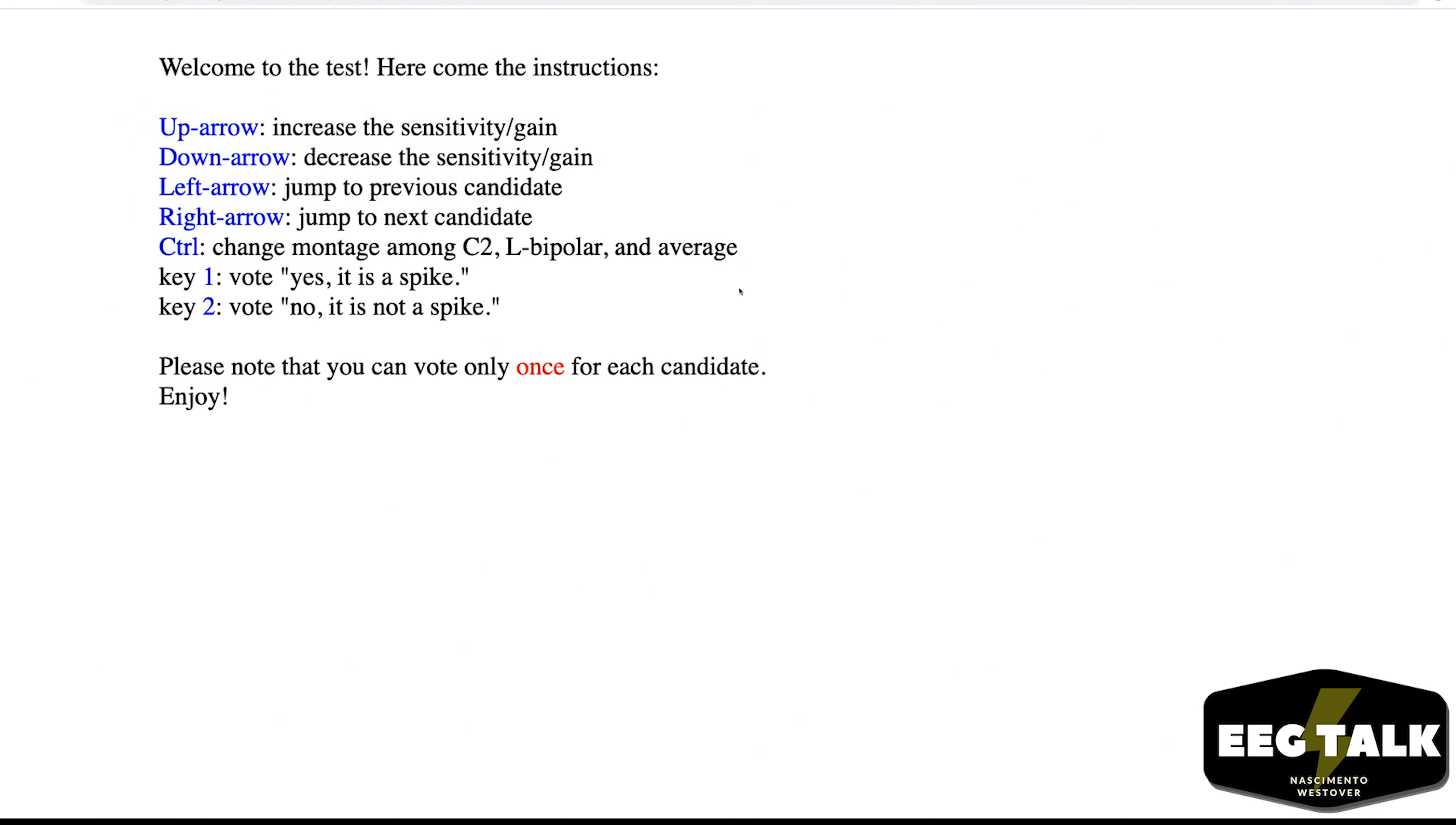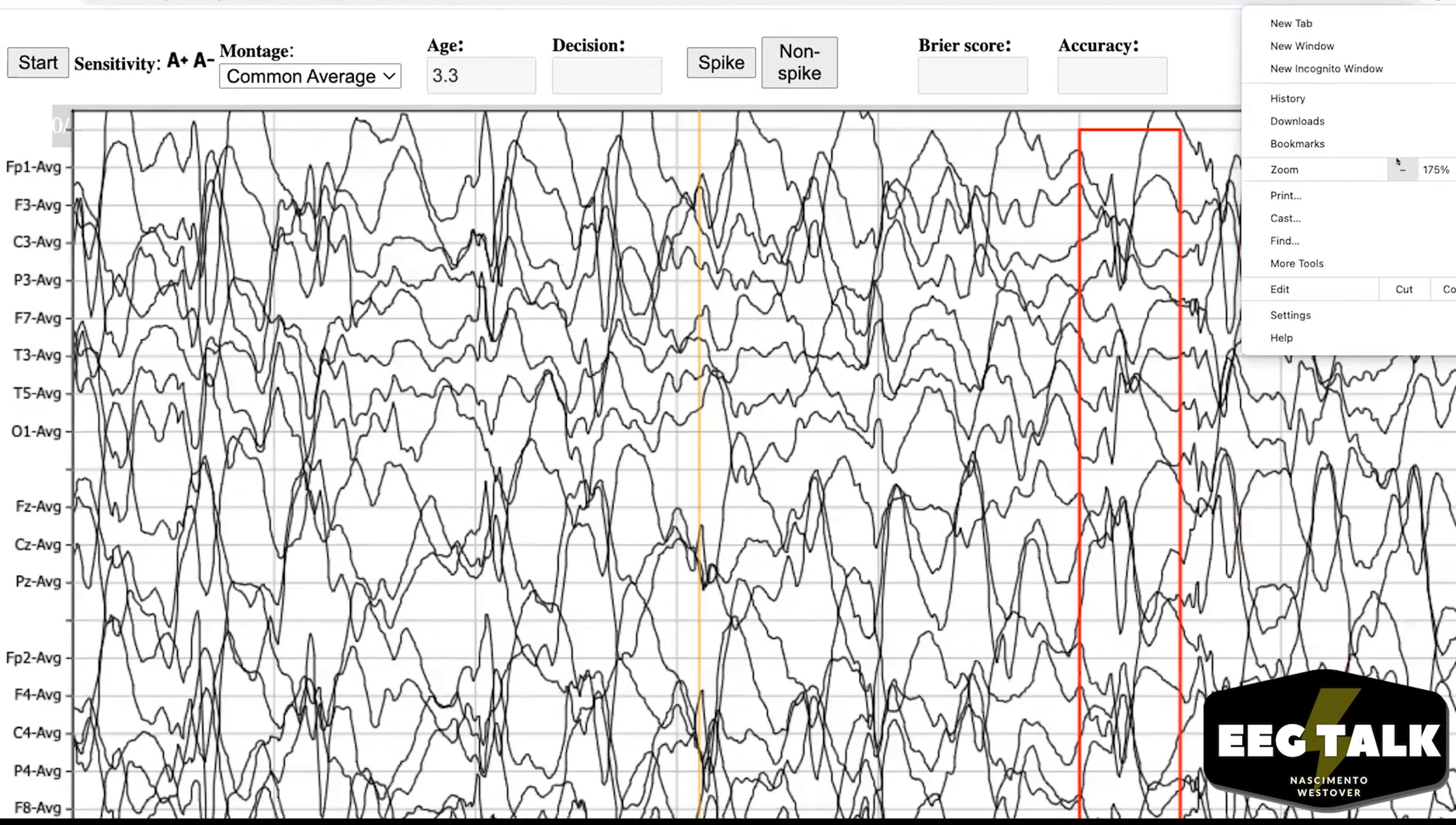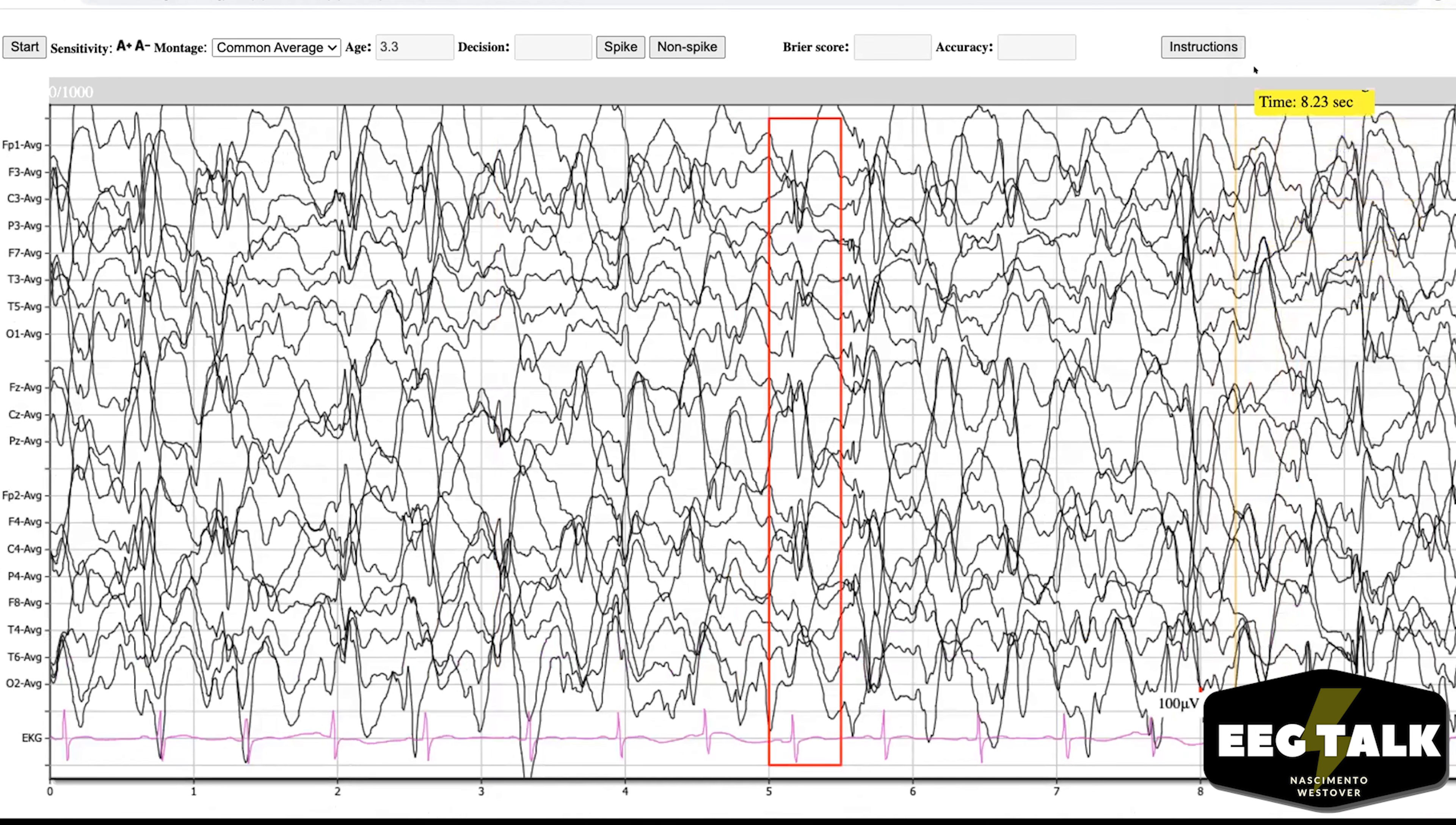And also, because your task is quite simple—just say yes or no whether it's a spike or not—you can use button one or two to do that really fast. Are they all like, is the right answer yes for all of them? Of course not. As we mentioned, we have a group of eight experts, so we have spikes from different levels of consensus from the experts.